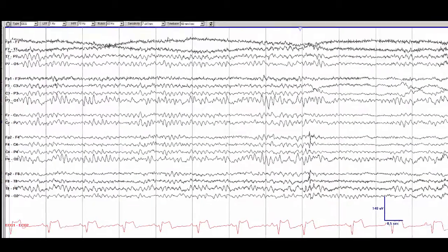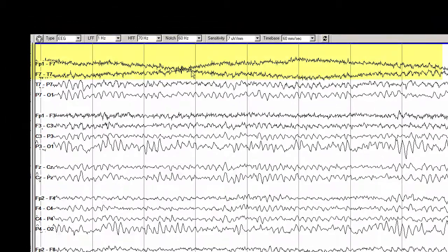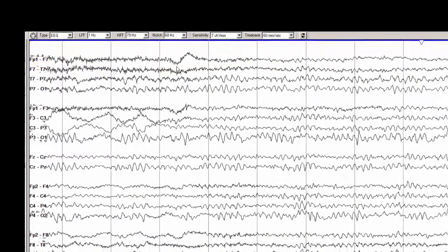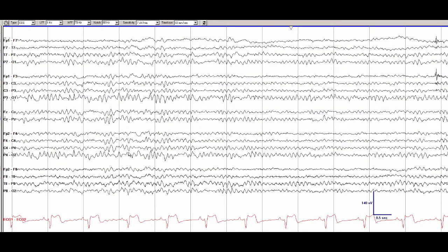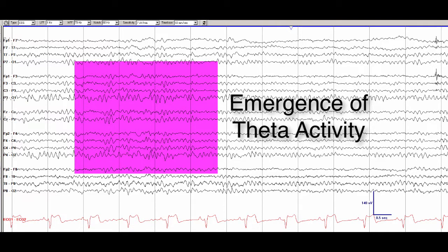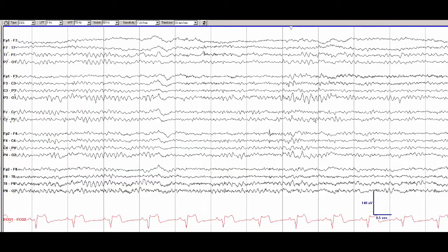This patient is probably drowsy as evidenced by the slow roving eye movements seen in the temporal chains. Then we start to see a loss of muscle artifact, the emergence of some theta rhythm and mild slowing and anterior migration of the posterior dominant rhythm. This patient is now drowsy.